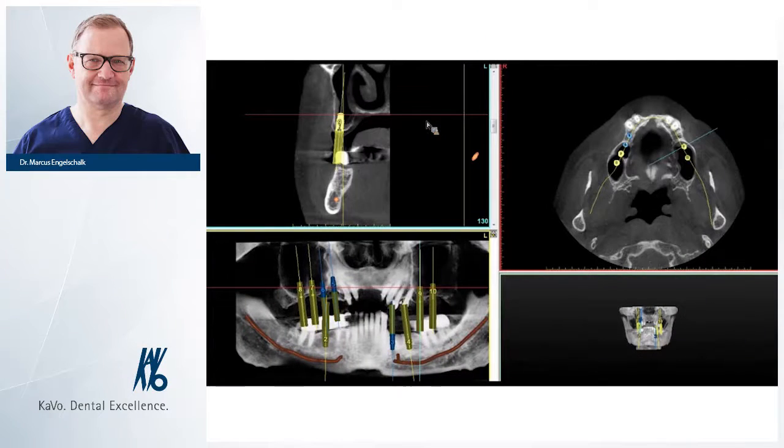It's very, very important to know what you can expect with these septums. Just a short piece of information: if you do this cone beam, it depends on the window you want to see. So you can do this with your X-ray very, very clearly, so that you only see what you want to have.